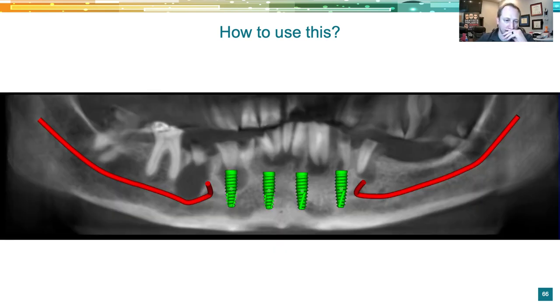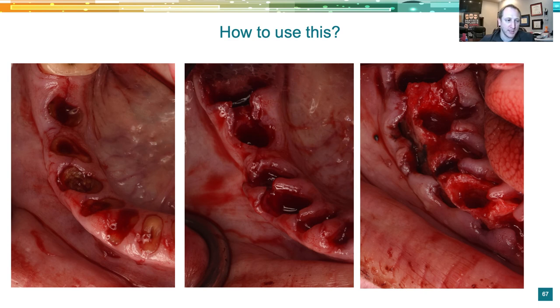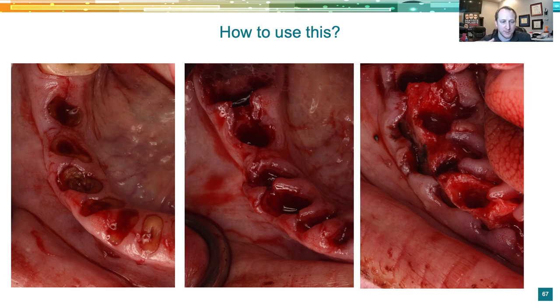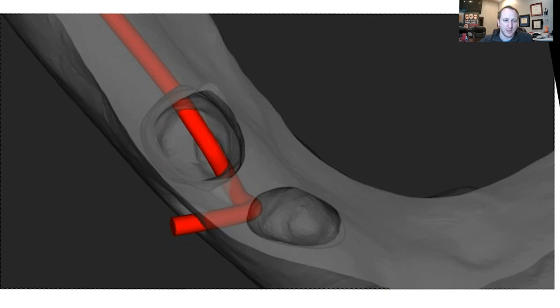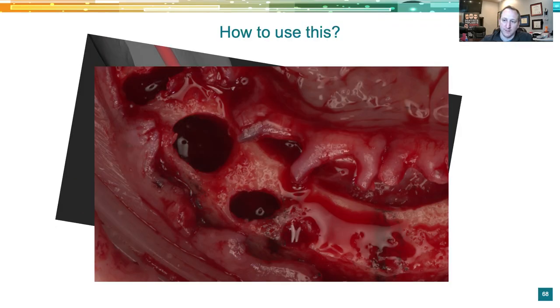The plan: four implants in between the foramen, clean out all the infection, and put PRF or collagen plugs in the area — no particulate near the nerve. Pre-op, the patient doesn't look particularly swollen externally. We do a full-thickness flap, remove all root tips, and perform alveoplasty as digitally planned. An interesting finding: as you're doing alveoplasty on the socket, the socket itself gets bigger, revealing the large cystic lesion.